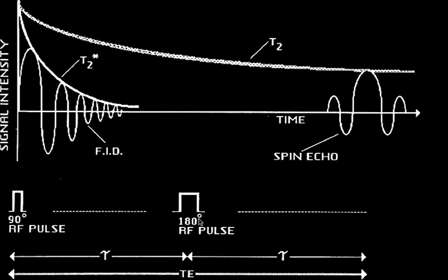Ram? A couple of questions. First of all, when we have the tissue in the magnet before we even give our first 90-degree pulse, the bulk magnetization points along the z-axis. Now, the 90-degree pulse is a short pulse, right? It's a finite pulse you give that throws everything into the XY plane. It can be as short as you want. It's a combination of how long it is and how strong it is. So typically we'll use a short pulse that's relatively strong. It may last less than a millisecond.